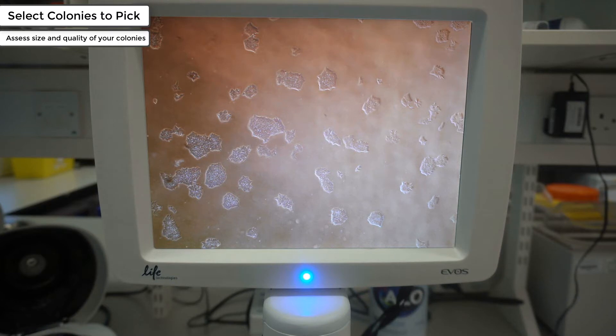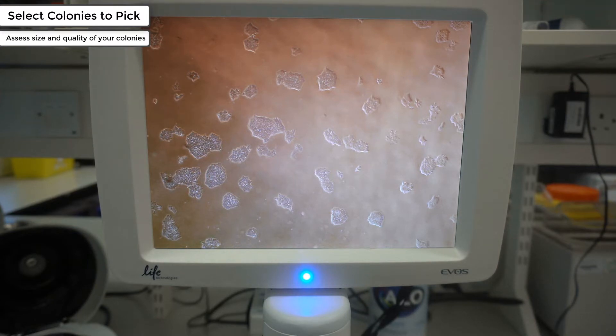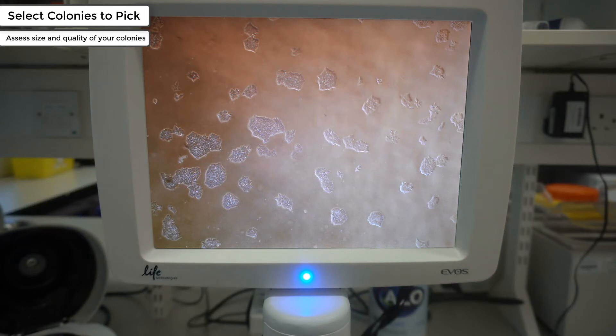When colony picking, it is recommended to start around 15 days after transduction. You can see the dish has a variety of different cell types. Some of them are partially reprogrammed cells in the top left-hand corner. You can also see some colonies starting to overgrow — demonstrated by the darker area — due to the cells being forced to grow upwards instead of continuing to grow flat across the surface of the plate.